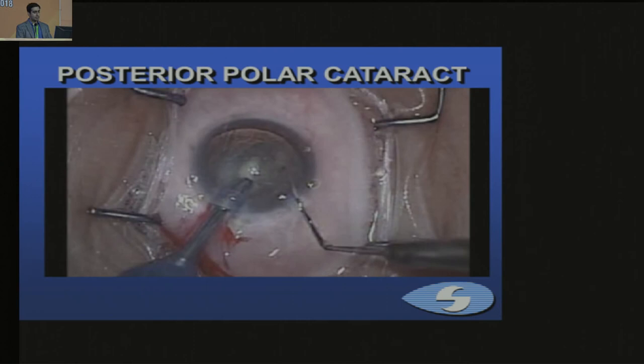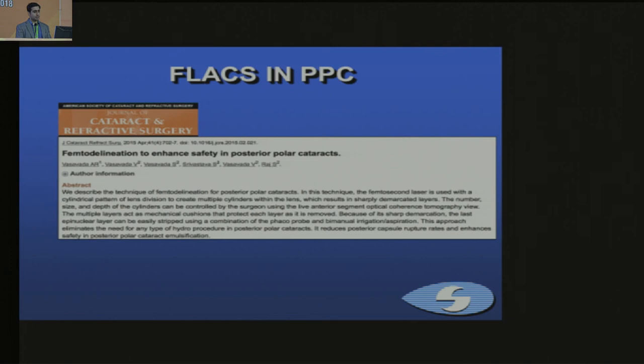Femto has also been proposed for use in posterior polar cataracts because you do not need hydrodissection — the femto itself performs a delineation. This has been described by Dr. Vasavda's group, where they used a cylindrical pattern in three different cylinders. You then pull out each cylinder individually, leaving an epinucleus plate which you pull out at the end.